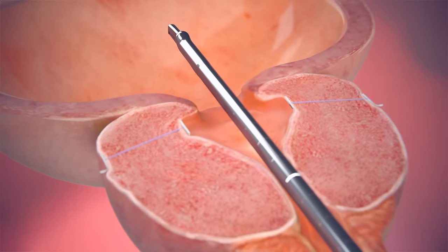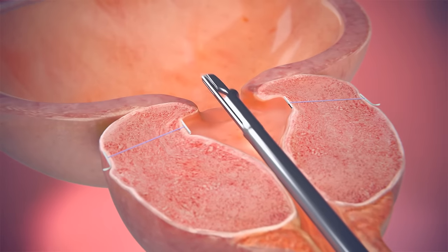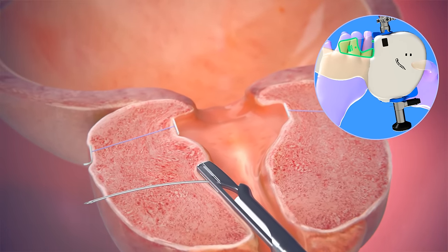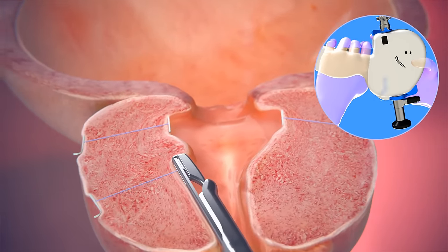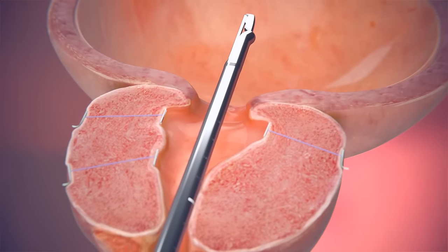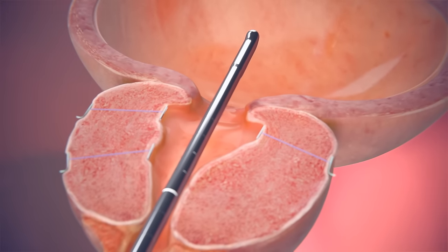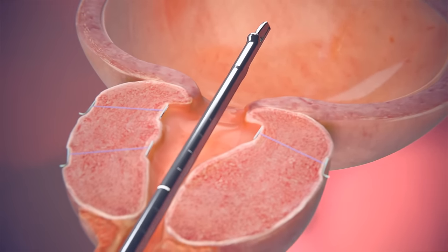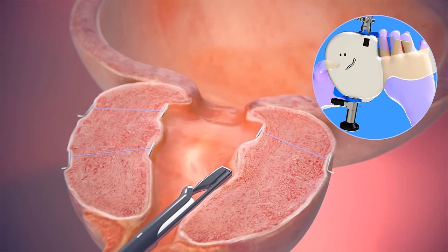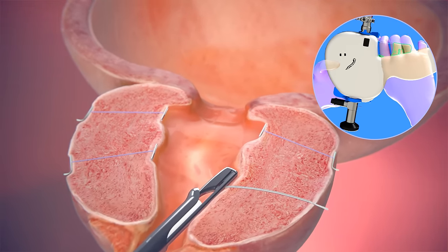The outer capsule of the prostate is firm and provides a solid anchor, which allows the implants to lift and hold the enlarged prostate tissue out of the way so it no longer blocks the urethra. As the sutures are shorter than the prostate depth, the prostate laterally compresses. This reduces pressure on the urethra and provides immediate visible results so urine can flow freely.